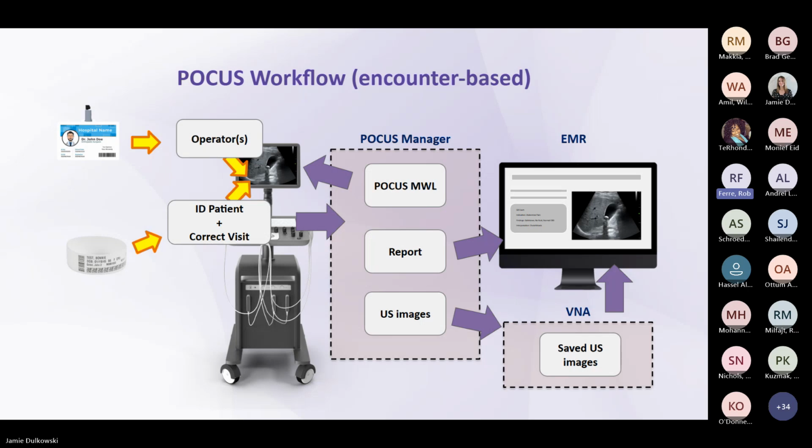Those operators are managed by the POCUS manager in knowing if they have point-of-care ultrasound privilege or if they do not. One of the core components of point-of-care ultrasound is that it is different than traditional workflows in that we are always training new physicians to become privileged. And so there's always some element where I have someone doing point-of-care ultrasound exams that may not be fully privileged to do them, and that needs to be accounted for.